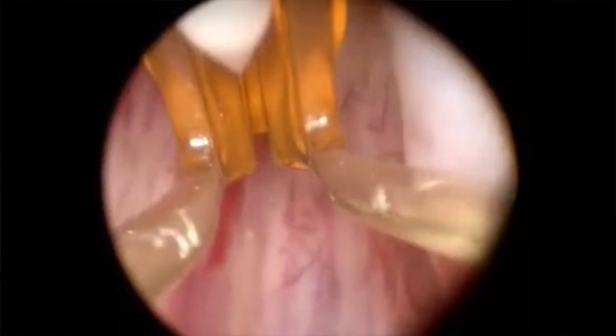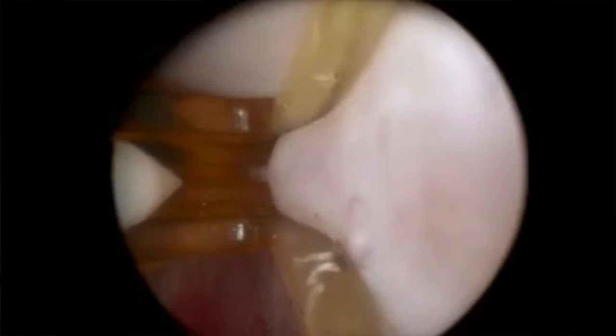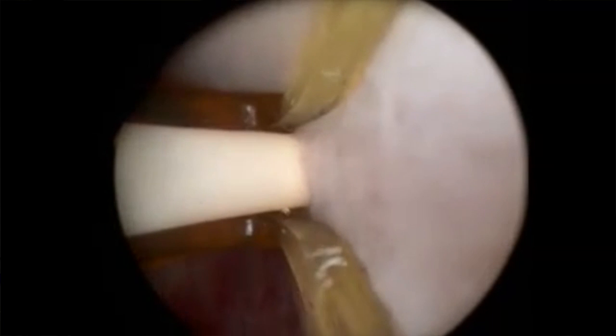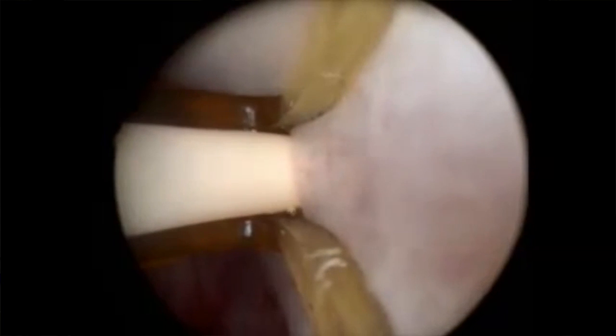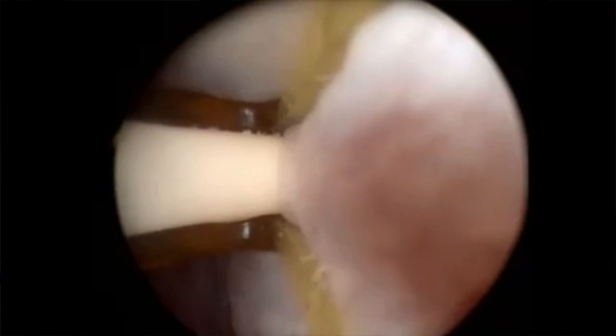The other option is Rezum, or steam therapy for the prostate. This is an exciting procedure too. Rezum involves the scope entering into the urethra, and we deploy a few milliliters of steam. The steam goes into the prostate and the heat is deposited there, and the steam goes through all the different boundaries between the cells of the prostate, and it disrupts these cell walls, which then causes the cells to die and involute, creating an open space.